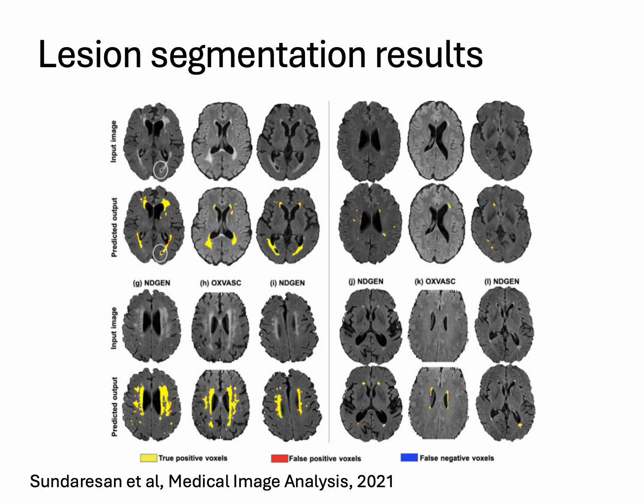So for more details you can always read the paper, but what I wanted to mention here is that we have obtained very good results for the deep lesions as well, the lesions that are farther away from ventricles, which has been quite a challenge for various automated algorithms.